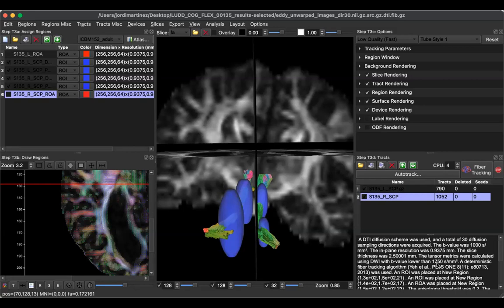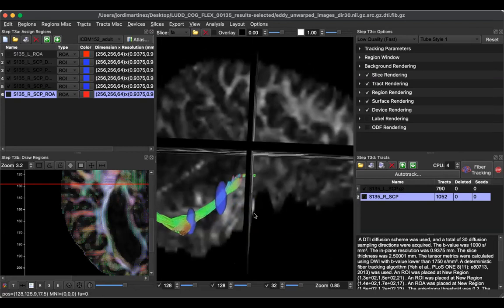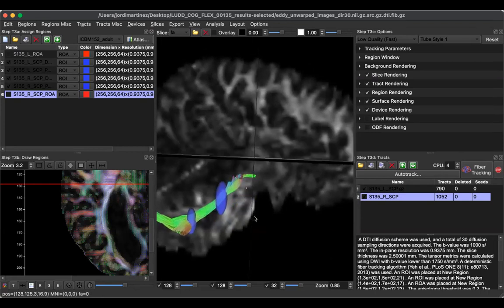Is this the patient you have up? This is the agenesis patient. It's much harder to find the cingulum in these patients because there's no corpus callosum, so the two hemispheres are closer. I didn't even think about that. Maybe that's the other question I was asking, because she had agenesis. She had normal development, so that's why she had it. She definitely had a cingulum, but it was damaged when the surgeon goes in and cuts, it damages the cingulum. So this kid doesn't have a cingulum at all.